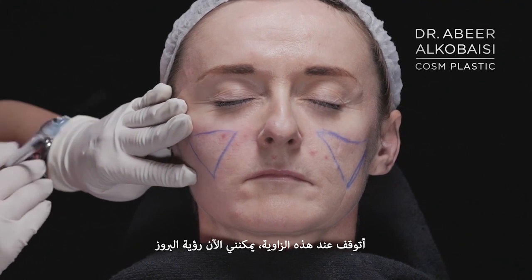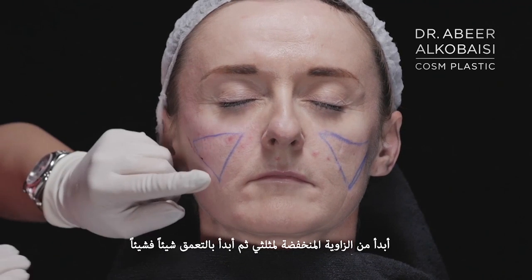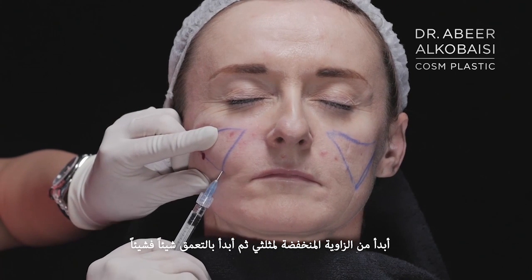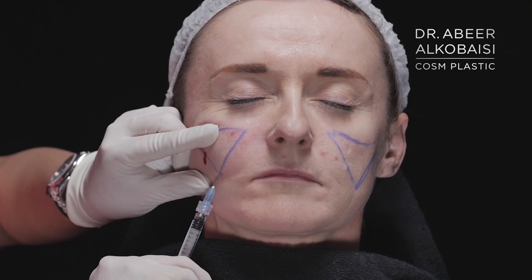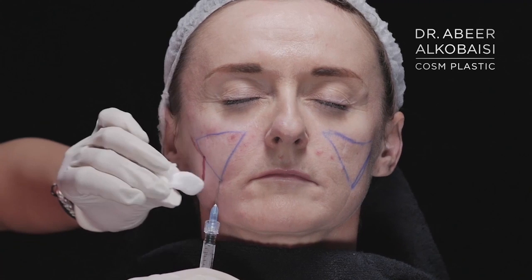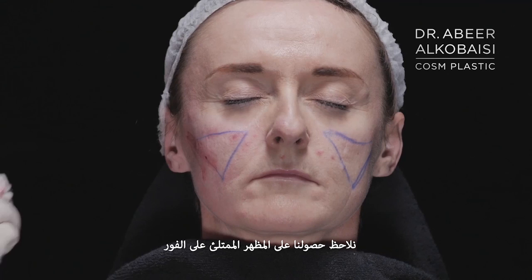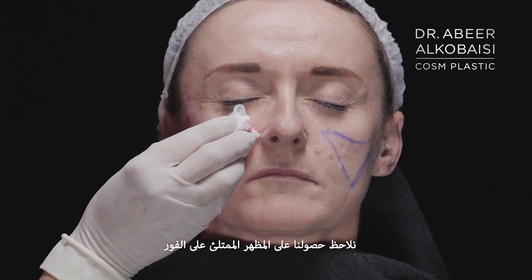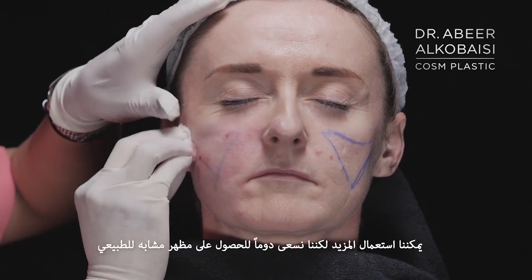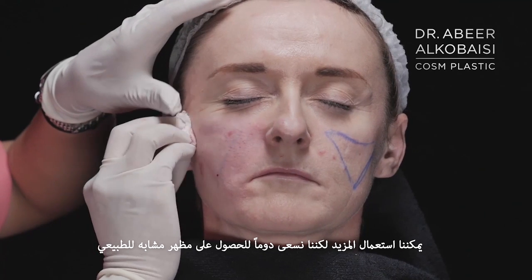I stop from this angle. I already can see the projection. I just need to start from the lower angle of my triangle and go all the way deep. The volume has immediately got restored. We still can go for more, but we always go for the natural look.